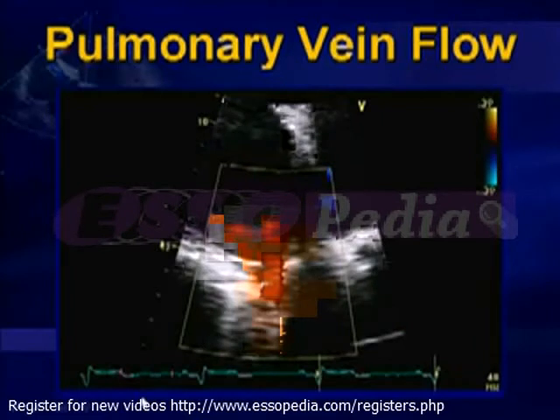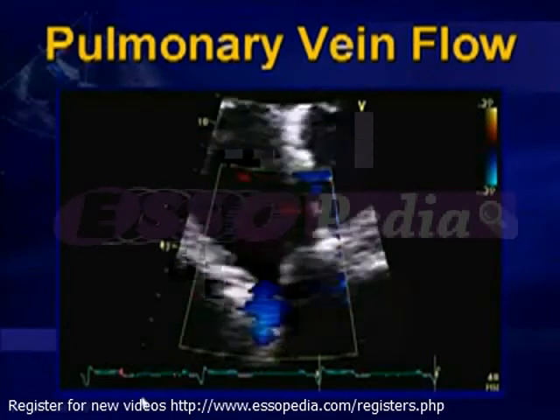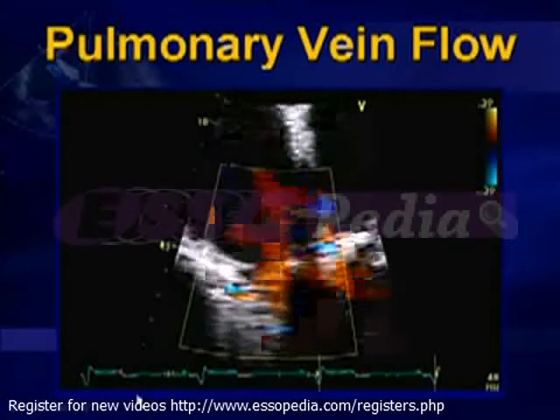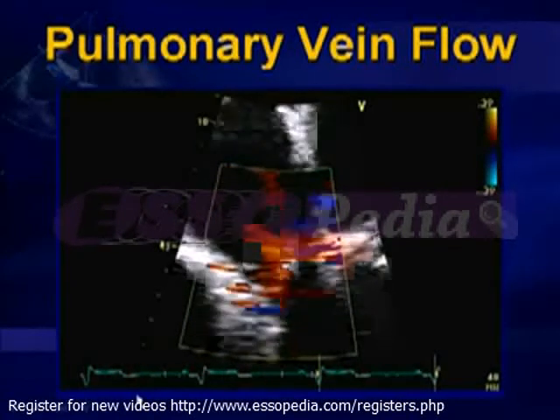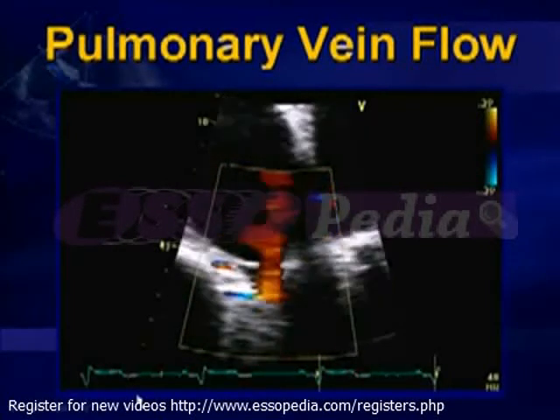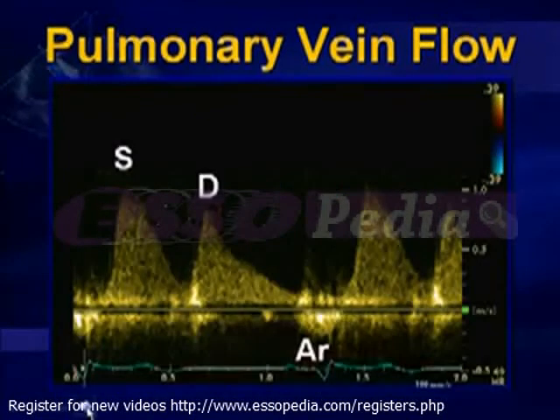At times, information gleaned from the pulmonary venous flow profile can be instructive. This is generally acquired from the apical four-chamber view, with color flow imaging helpful to guide the location for placement of a pulsed wave sample volume, which is generally about half a centimeter into the right upper pulmonary vein, using a 2 to 3 millimeter sized gate.